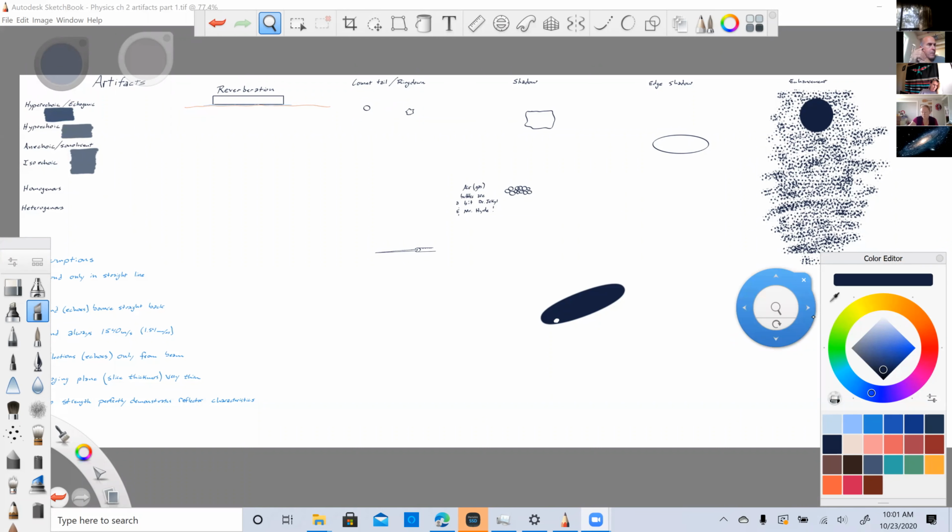Yeah, so this is chapter 21, all about breaking the rules. All the rules of ultrasound are going to be broken or altered. And when we violate those rules, we usually get an artifact on our screen. So starting on page 355, types of artifacts.